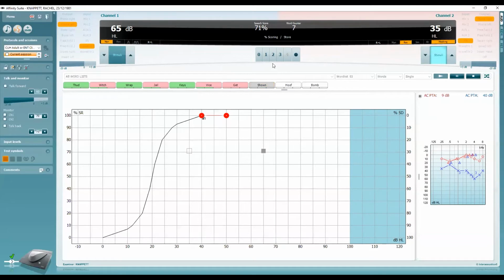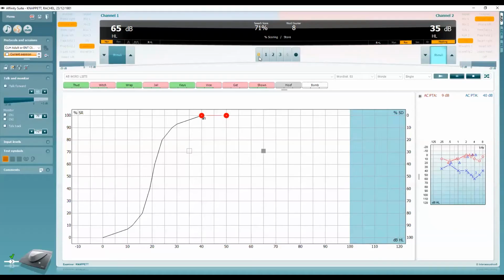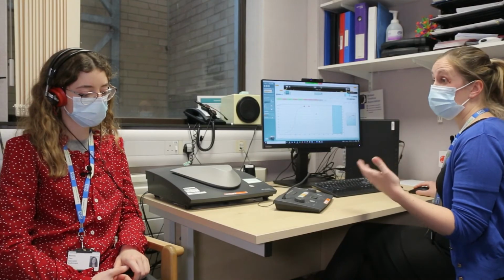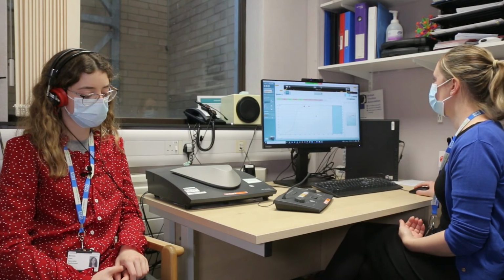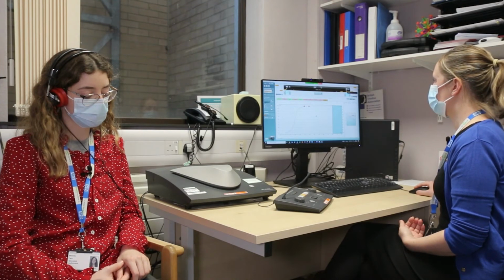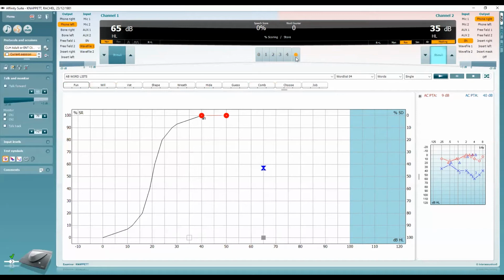Moan. Can't really hear. So she didn't get that one again, but I'm confident that she is guessing and she's trying. If you have a patient that doesn't seem to be getting any, then it's worth just reminding them to make sure that you guess the words where you're not sure. Can't really hear that. Okay, so she scored 57%. I'm going to store that.